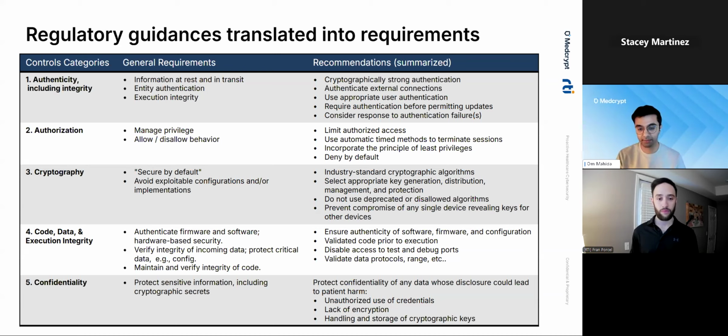One of the most common mistakes we see in the industry is the reuse of keys and certificates across a fleet of devices. What you really want to do is create a boundary, making sure each device and even maybe each type of service has its own unique key, right? That ensures common security issues like, hey, a hacker getting access to one device, being able to read the cryptography key off the device, isn't able to compromise your entire fleet of devices.